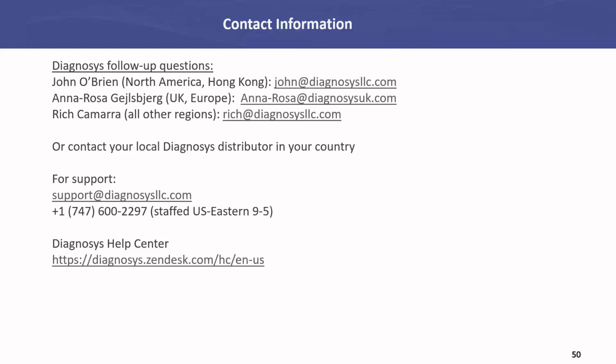But the thing is that we're imposing this artificial tiny little aperture. For the mice, it's 1/4 of a millimeter in diameter. For rats, it's 2 millimeters in diameter. So even if your mouse is fully dilated or your rat is fully dilated, we're imposing this artificial pupil on them. So you want to make sure their pupils are as big as possible so that you're lining up right on the middle of that target. In terms of placement, you want to be coming right down the optical axis of the animal. So it's sort of like a 45-degree angle from where they're looking.